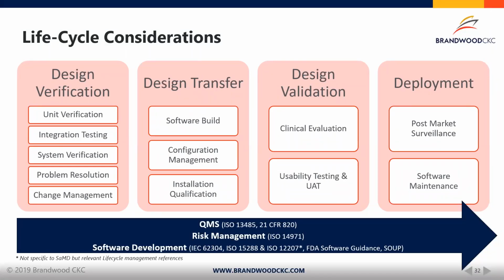The development process continues into design verification and design transfer. Depending on how the software is deployed, some qualification and infrastructure may be required. And design validation includes user acceptance testing or usability testing, and importantly, clinical evaluation, and Jean will discuss it in more detail shortly. And finally, once the software is deployed or released, the software lifecycle process includes software maintenance and post-market surveillance activities.